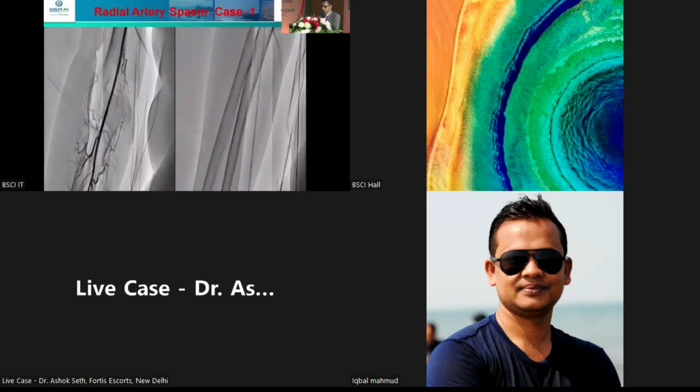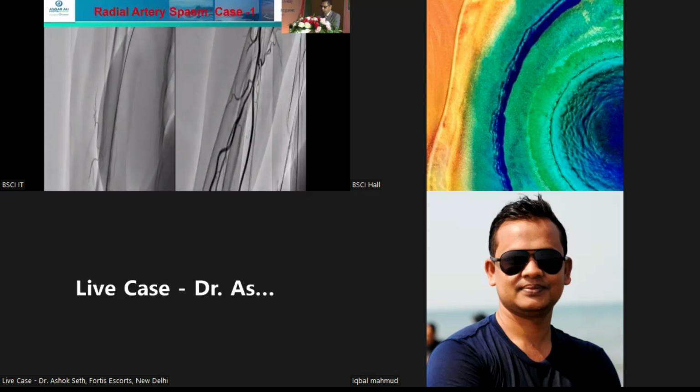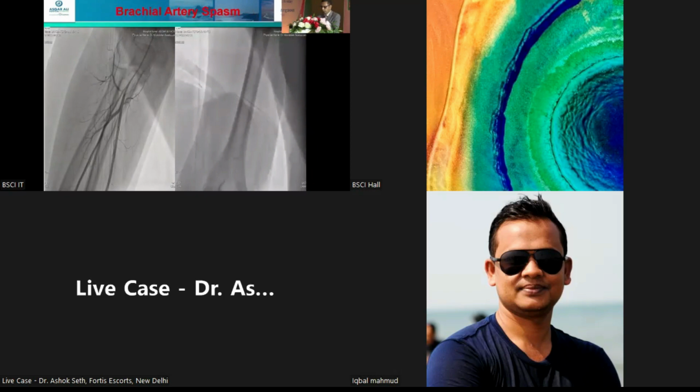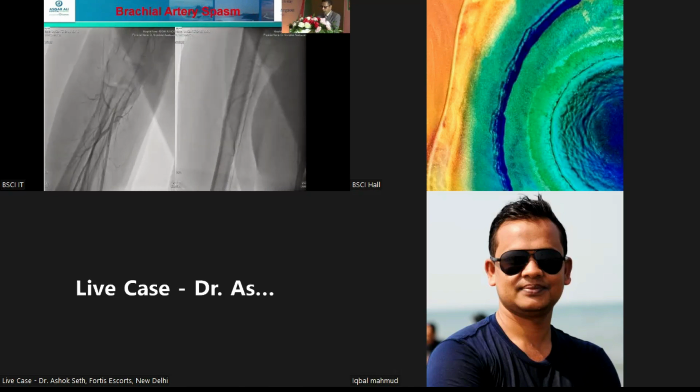There is a diffuse spasm. And also the severe brachial spasm as well.